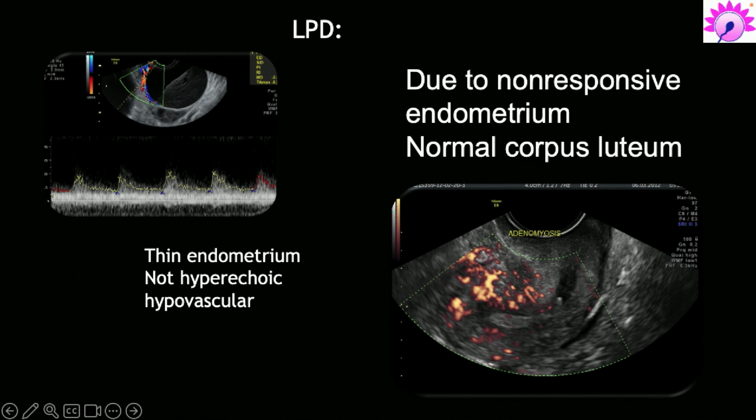What do I mean by estrogen priming, and how do I evaluate whether it is adequate or not? Consider the duration of estrogen exposure to the endometrium, from the day of dominance till the day of trigger. If follicular maturity takes 4 to 6 days, that is a sufficient estrogen exposure. And on the day of the trigger, if you have checked that the follicular flows are adequate, that means the estrogen level is adequate. So the duration is adequate and the amount is adequate. That tells you the estrogen priming of the endometrium should be adequate.